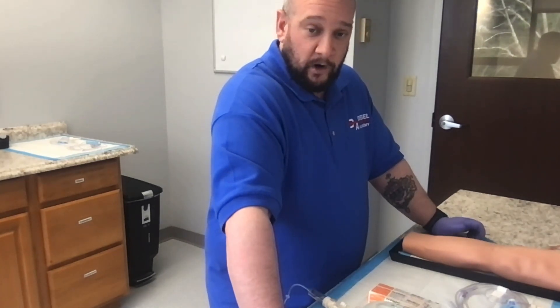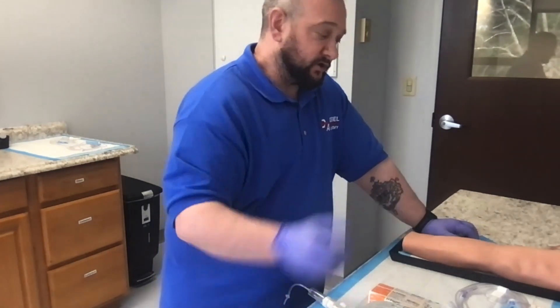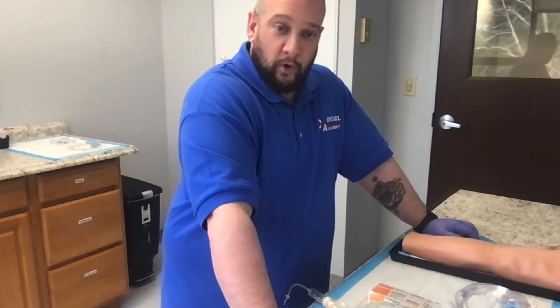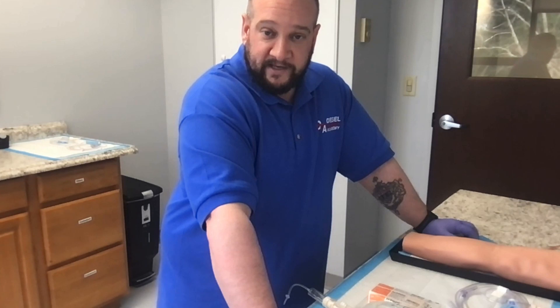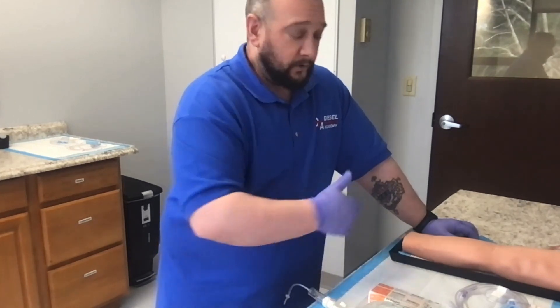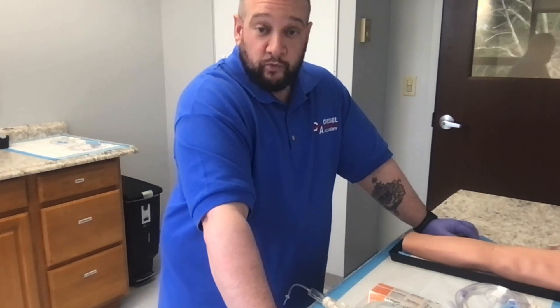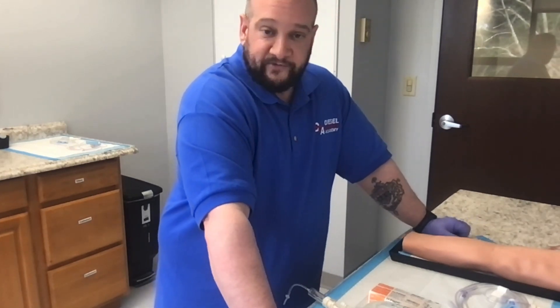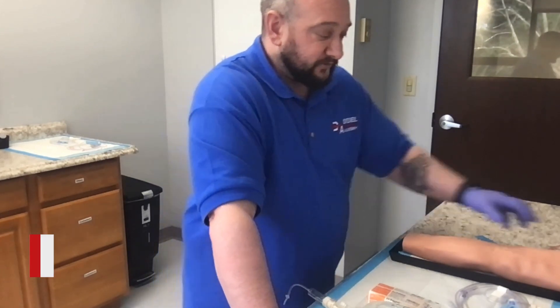When we need to get a line in to give medication or fluid resuscitation, we always go to IV first. As an ALS provider, IO is an option, but the standard of care expects at least two, if not three, IV attempts — ideally by one or two providers — before going to IO, unless there's a reason to go directly to IO. Make sure there are no signs of infection, no breaks or fractures, and that you have a good arm to work with.